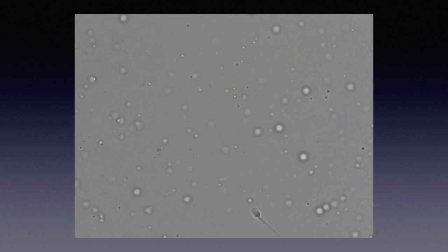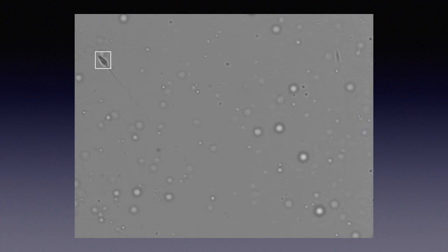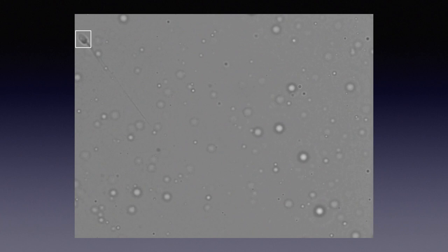Using the recorded videos, we employed a technique called Multiple Instance Learning Tracking, or MILtrack, which allowed us to select a spermatozoan and track it automatically throughout the video. This software technique, which is not yet commercially available, adapts to changes in the appearance of the object while tracking it. Since spermatozoa swim in a corkscrew or helical pattern, we are able to see the entire sperm surface after tracking the sperm for just a few seconds.